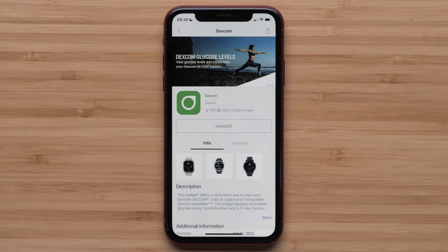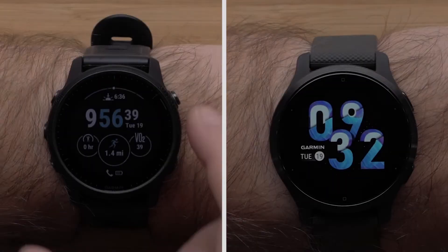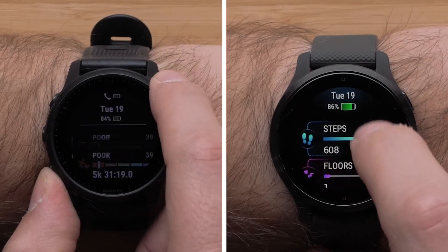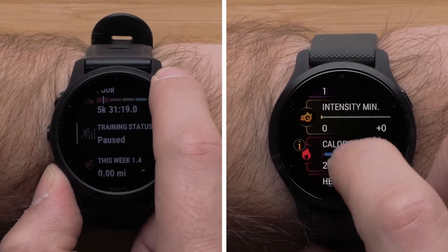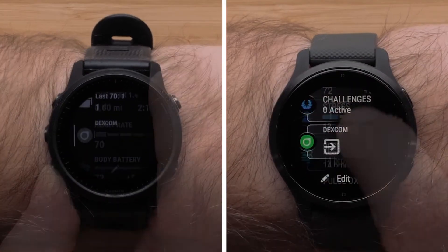Once the widget has been installed on your watch, scroll down through your widget loop to find the Dexcom widget.